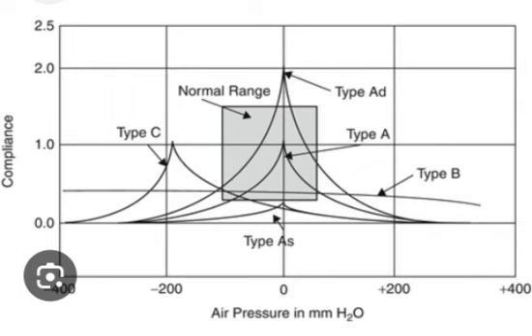A normal tympanogram is labeled type A. There is a normal pressure in the middle ear with normal mobility of the eardrum and ossicles. Type B tympanogram may reveal fluid in the middle ear, perforation of the tympanic membrane or patent pressure equalization tube, or a tumor in the middle ear.